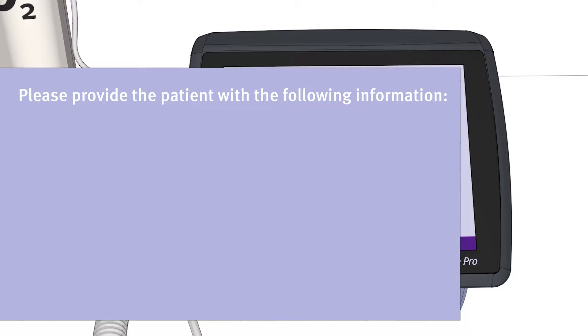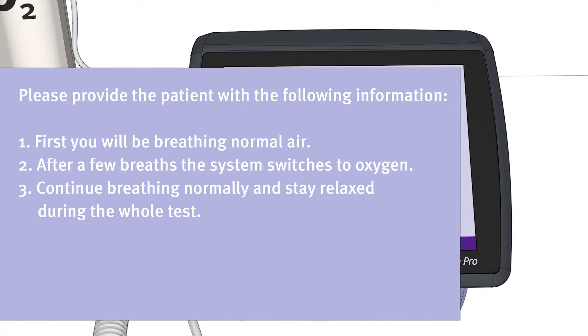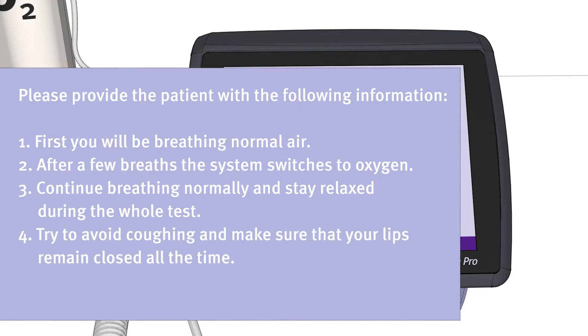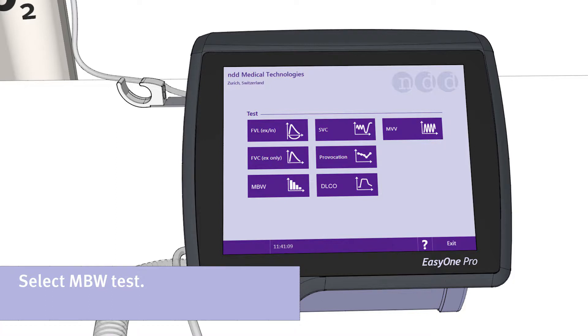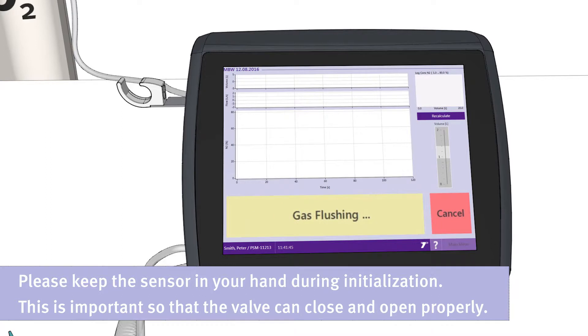Please provide the patient with the following information. First, you will be breathing normal air. After a few breaths, the system switches to oxygen. Continue breathing normally and stay relaxed during the whole test. Try to avoid coughing and make sure that your lips remain closed all the time. The test will take around three minutes. Please press the button MBW to start the respective test. Keep the sensor in your hand during initialization. This is important so that the valve can close and open properly.